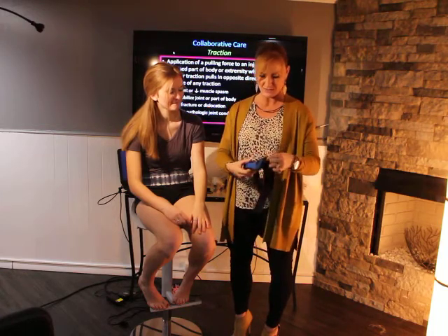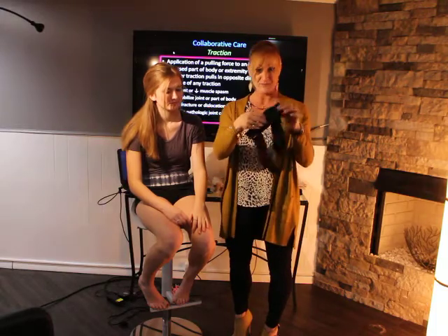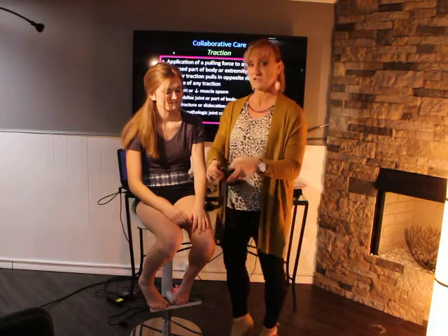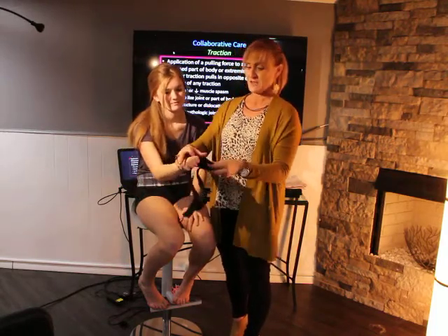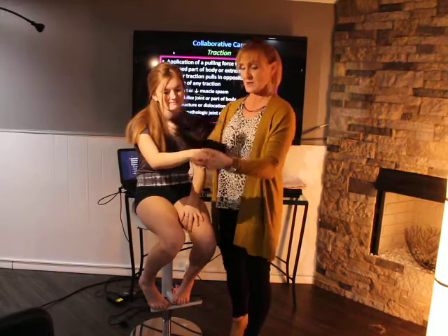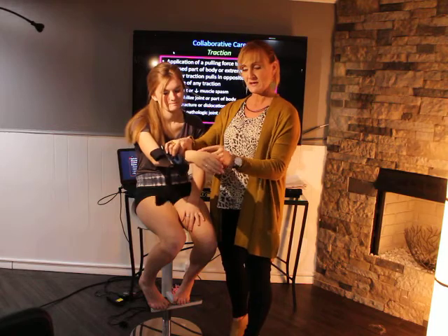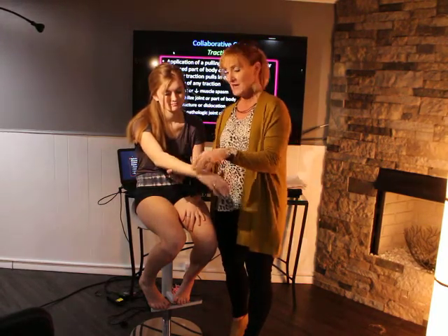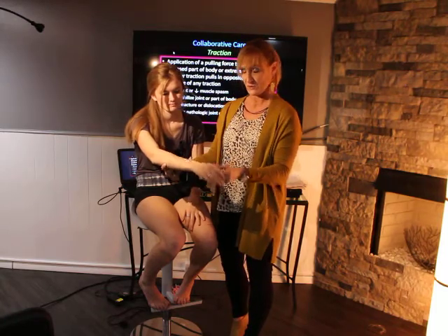So for example, this would be something for a thumb. So a thumb brace. Let's say that your patient perhaps fell off a horse and sprained their thumb. Now again, it's the joint right here and it gets sprained. The sprain again is the tendons and ligaments around a joint, whereas a strain injury is more of an overstretch of the muscle, not necessarily associated with the joint.